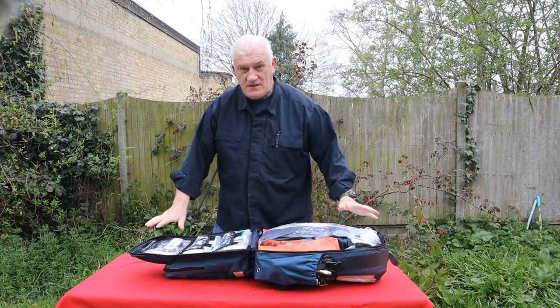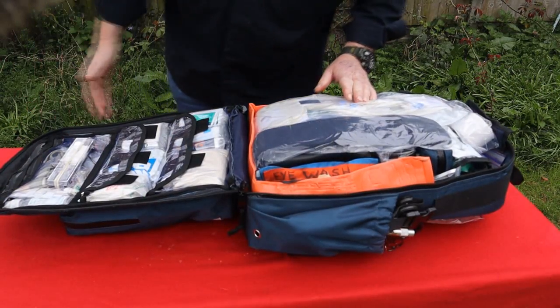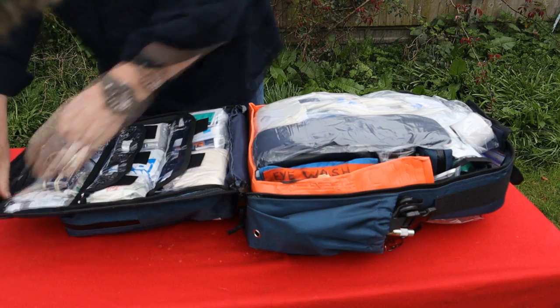Okay, so this is a basic life support bag. Bring it a bit closer, show you what we... Okay, let's start at the top. This pouch is just incidentals really. Emergency dental kit, some plaster.